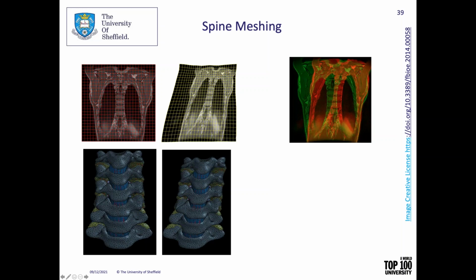So if you have, for the reference image, the optimal mesh describing, in this case, the spine, for every other patient or every other later time step, you can just register the new patient image to the reference one, and by applying this mapping, you can obtain the correct version of the mesh for the new patient. This is an artificial image to show these qualitatively. There is no work associated with this one. It's to explain how it works. There are plenty of other papers, but they cannot be used here for copyright reasons.